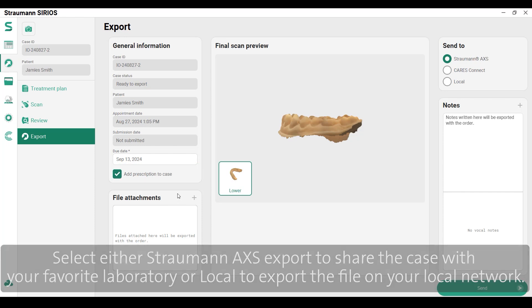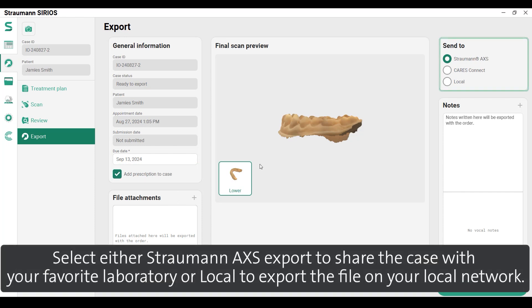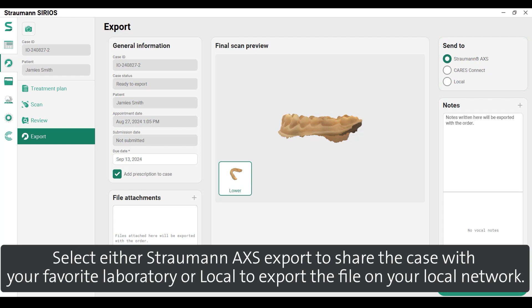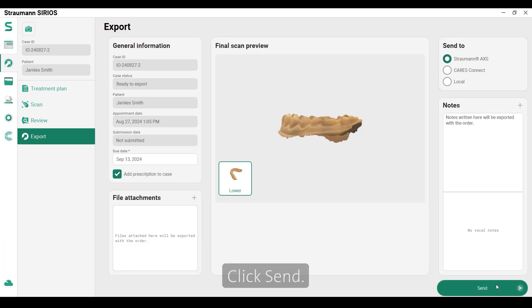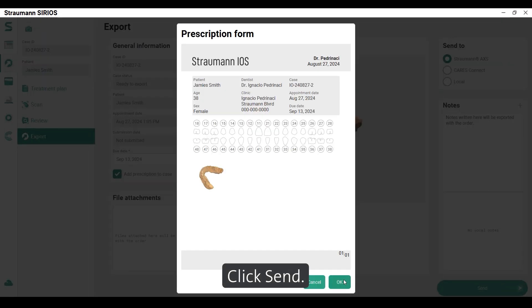Select either 'Straumann Access' to export and share the case with your favorite laboratory, or 'Local' to export the file to your local network. Click 'Send'.